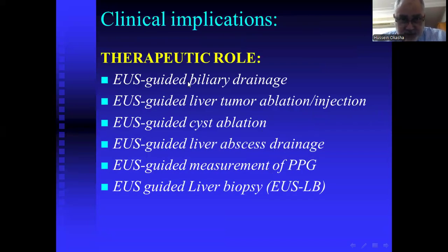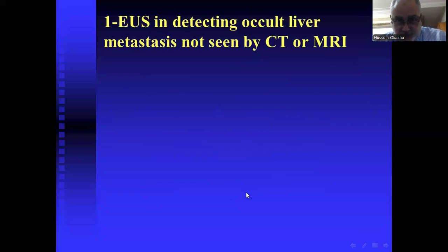Of course, there are many therapeutic implications. We all know EUS-guided biliary drainage, EUS-guided liver tumor ablation, EUS-guided cyst ablation, EUS-guided liver abscess drainage, EUS-guided measurement of portal pressure gradient, EUS-guided liver biopsy of diffuse liver pathology. Let us talk about some of the very important points.